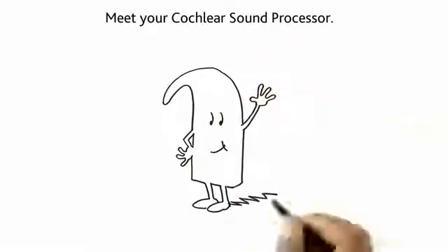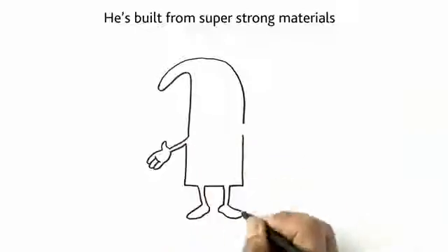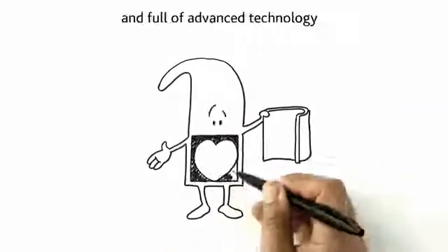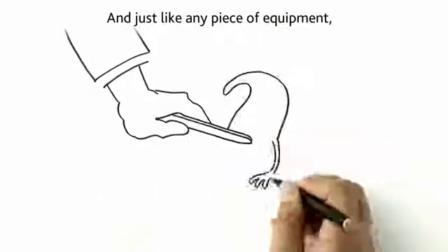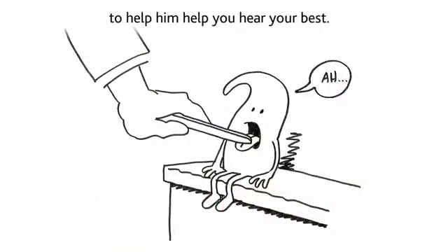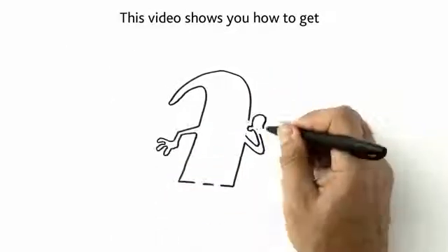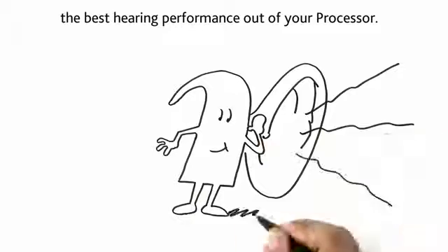Meet your cochlear sound processor. He's built from super strong materials and full of advanced technology, but he's not invincible. And just like any piece of equipment, he needs regular care to help him help you hear your best. This video shows you how to get the best hearing performance out of your processor.